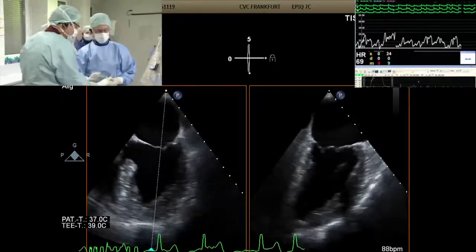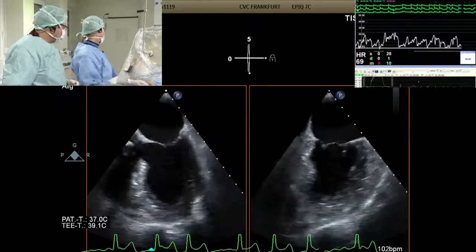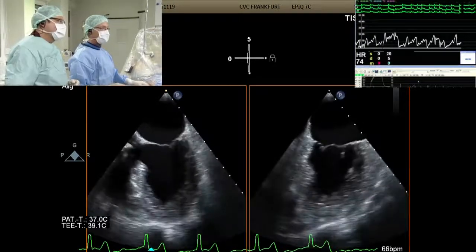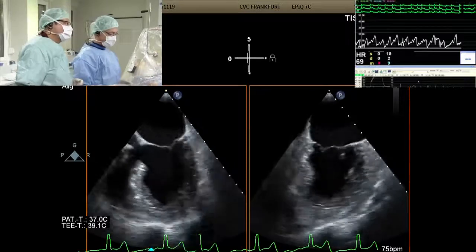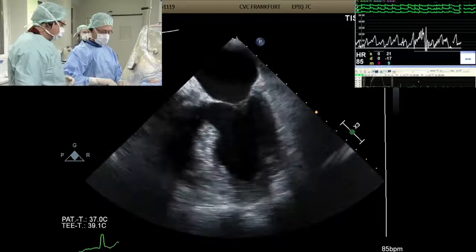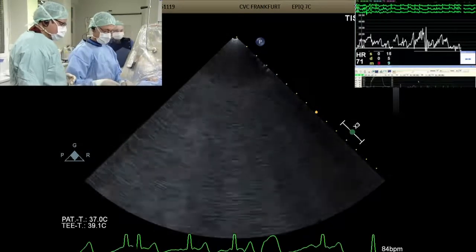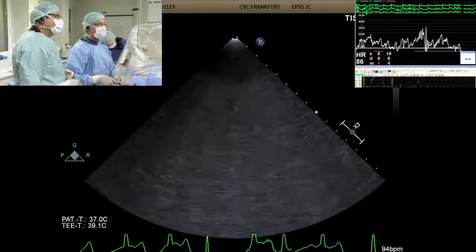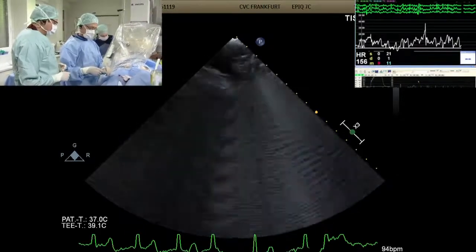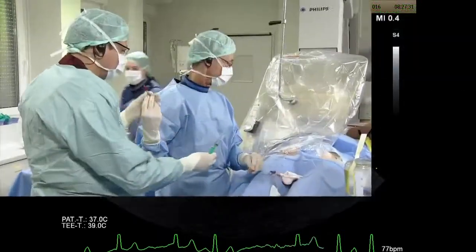And blood pressure, Horst, that's okay? We don't have invasive blood pressure measurements, but we can check with the cuff here. It's beginning to look less aggressive, I think. The pulse is coming down, isn't it? It's good. We will check ACT to make sure that she has enough heparin. No wall motion abnormality or anything else. I mean, it's probably a transient phenomenon. It's going to get better. It's settling, yes. Maurice just wants you to carry on now. Yeah, okay. Carry on. It's getting better. Yeah. So here's ACT.